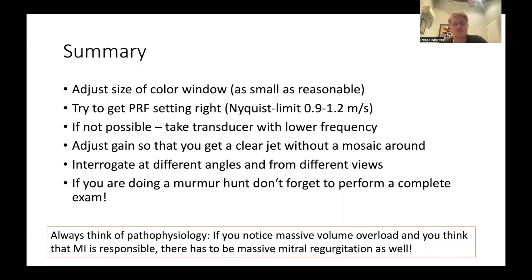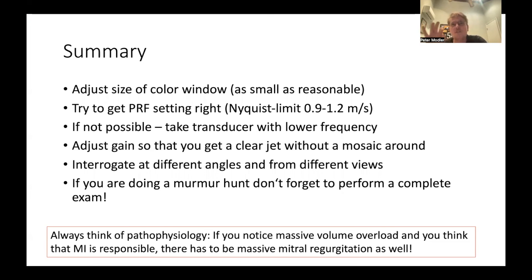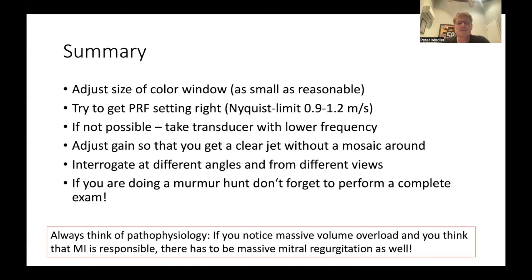If you're doing a murmur hunt, don't forget to perform a complete exam even after you've already found mitral regurgitation. Most importantly, always think about the pathophysiology. If you notice massive volume overload of the left heart and think mitral regurgitation is responsible, there must be a massive jet. If you see a heavy left-sided volume overload but only a tiny mitral jet, then the mitral regurgitation won't be responsible for that volume overload. If you're still convinced based on your two-dimensional image of the valve, consider that your settings might be wrong — the whole clinical picture has to fit together.